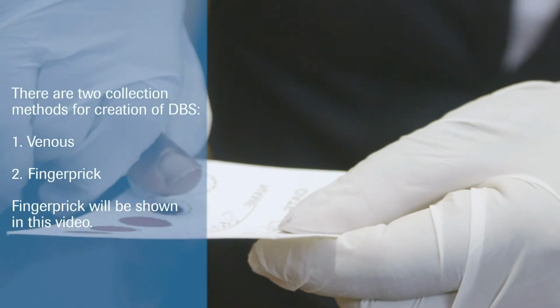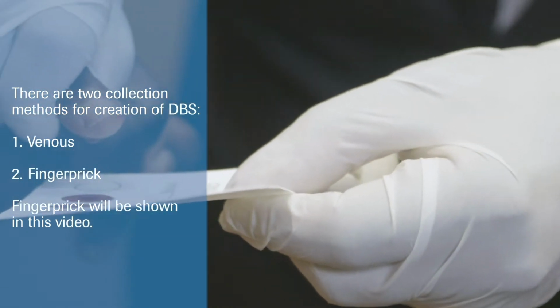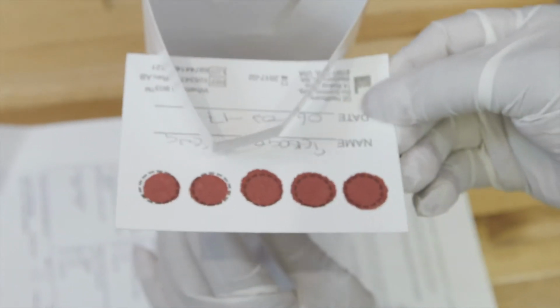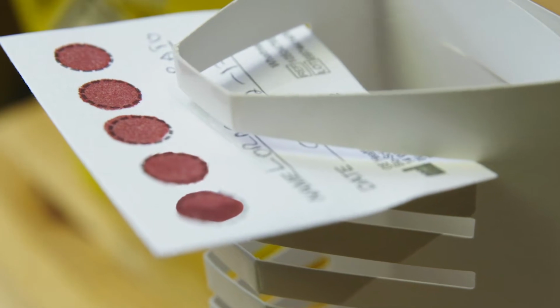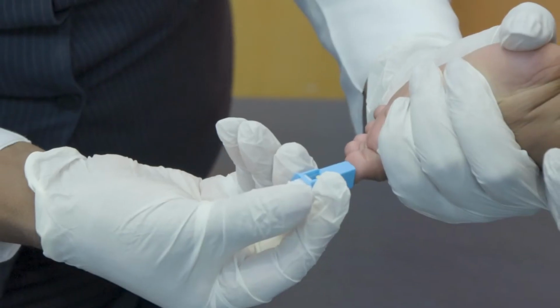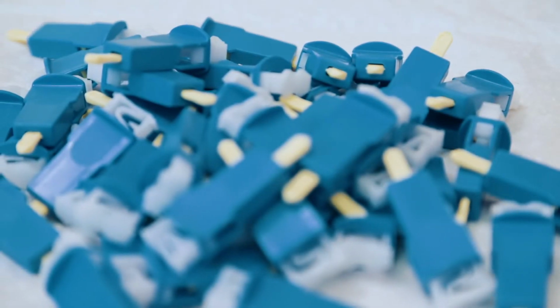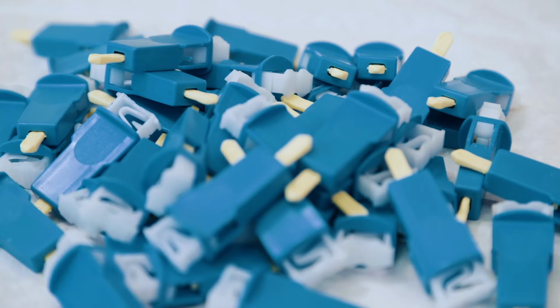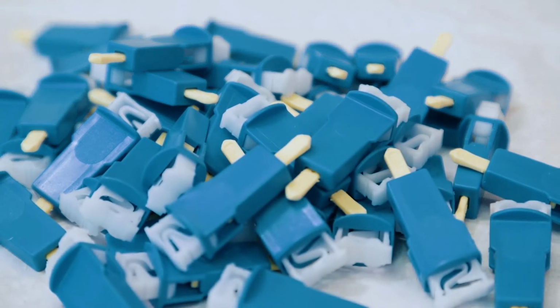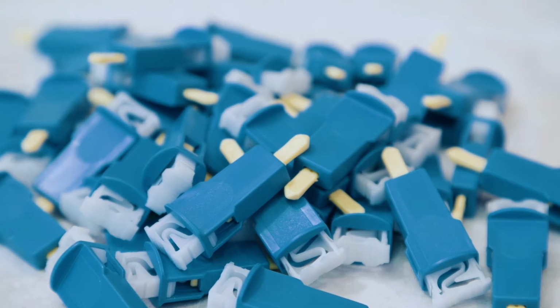This collection method can help expand access to VL testing more rapidly. This is due to several reasons. The samples are easier to collect from people of all ages, even very young children, and by providers that have minimal training. DBS collection presents less of a risk for accidental exposure to contaminated blood because there is no need to use large needles or glass tubes for collection.